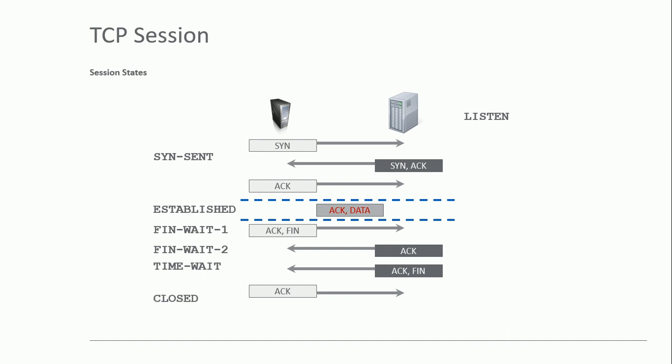I would say probably the most common that you'll see is on the server, you'll see listen, and on the client, you'll see established and time wait. The other ones you typically won't see. The other ones like fin wait 1, fin wait 2, you won't typically see those. You won't see SYN sent.